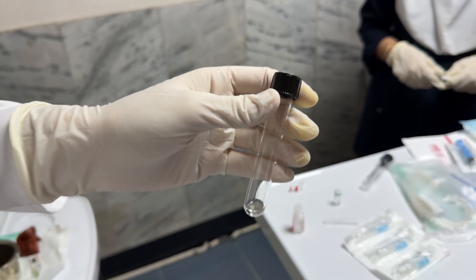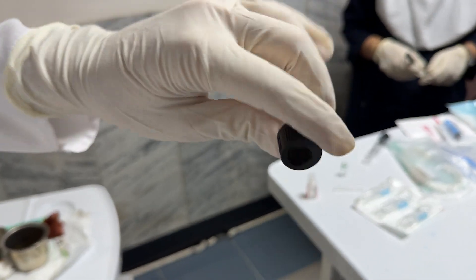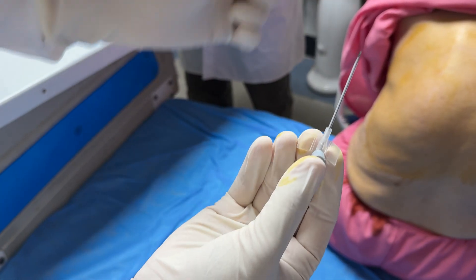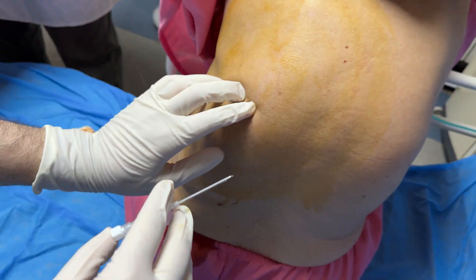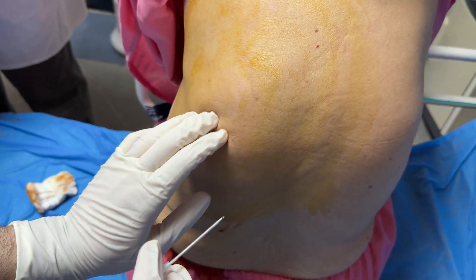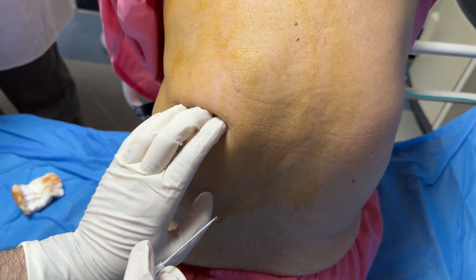With the introducer needle in hand, advance slowly, controlled and steady. We now thread the catheter gently into the pleural space and withdraw the needle.